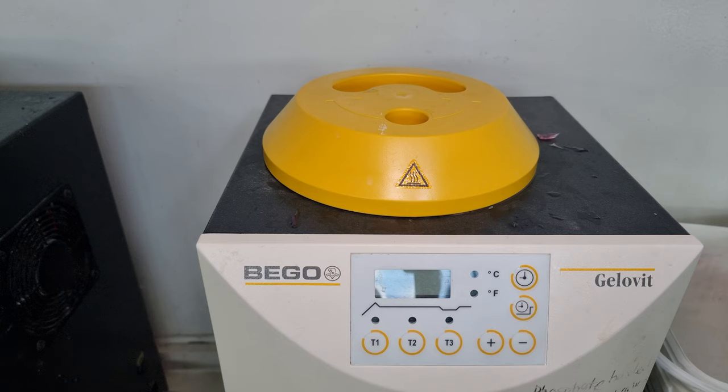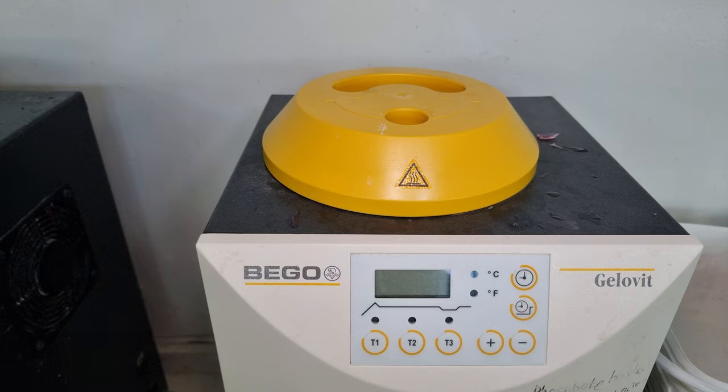Even the working temperature and melting temperature are different to each other. Each of these machines is set to follow the characteristic of the gel specifically, and the gel is composed to make sure it works specifically to each of this material, investment material.